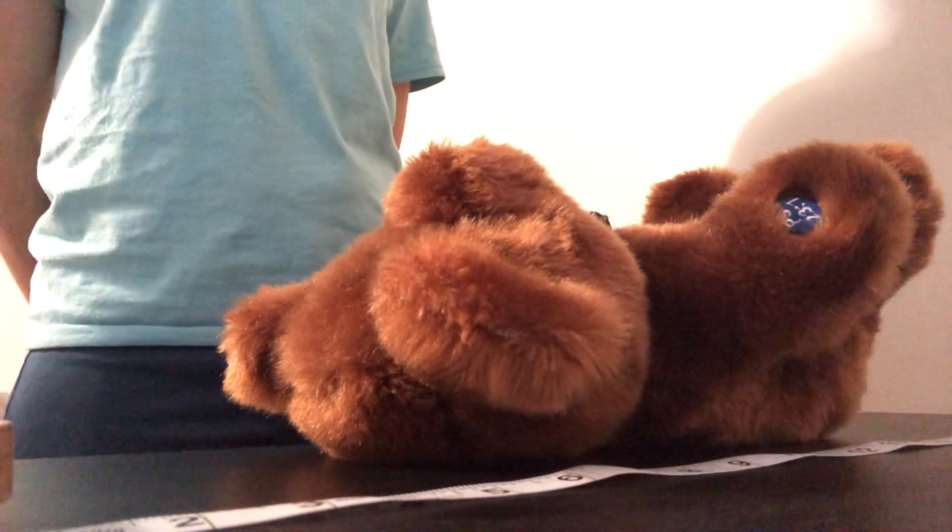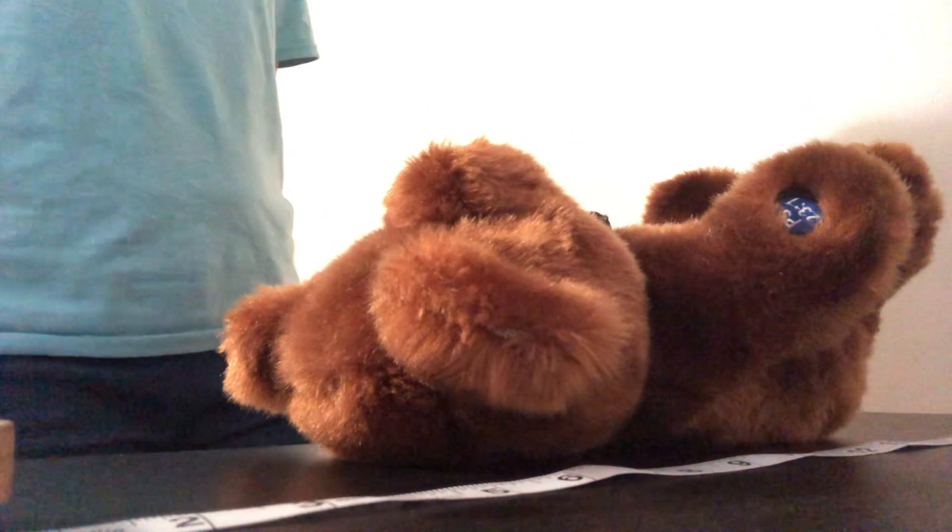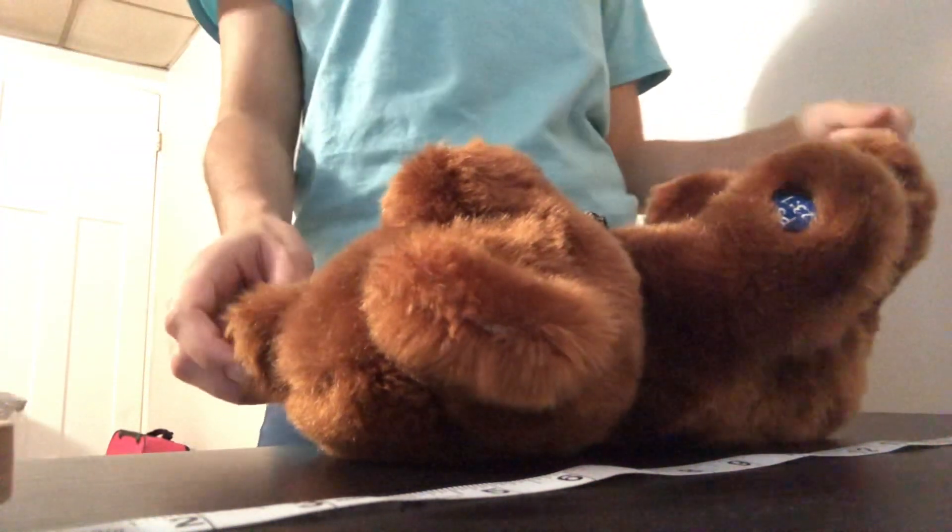I will then explain the procedure to the infant's caregiver, which is measuring the baby's length. After that, I'm going to take the infant's shoe off, and I can just give it to the parent.